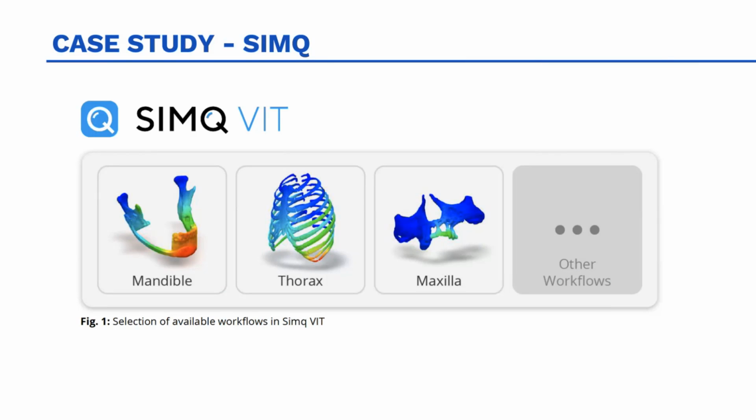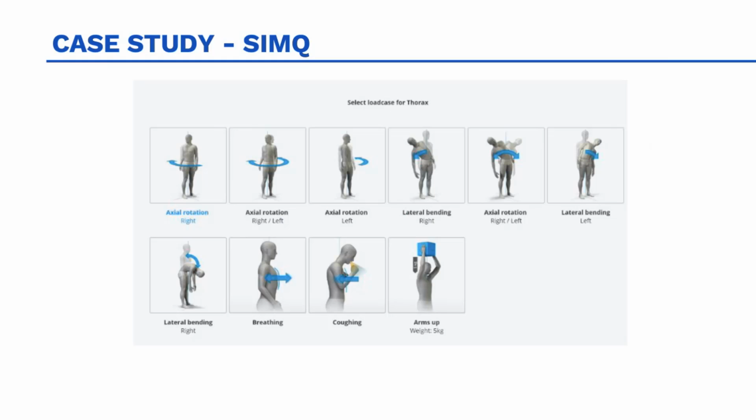There is one of our partners, CATVAM, and the company they founded, SIMQ. They do have a commercial software out there that's being used to evaluate jaws and upper portion of the skeleton. And they actually have these type of activities already loaded in the software, so you don't have to run the musculoskeletal simulation, because these cases are already run and they're already put into the software.